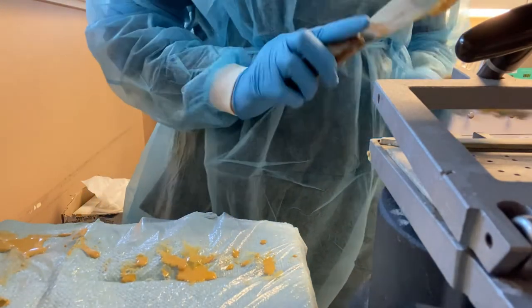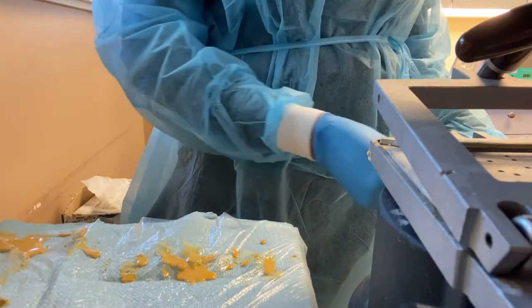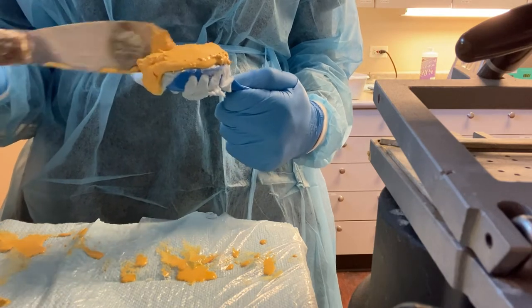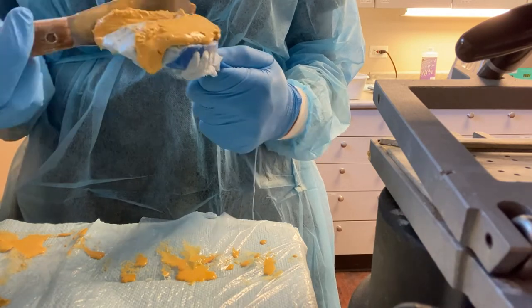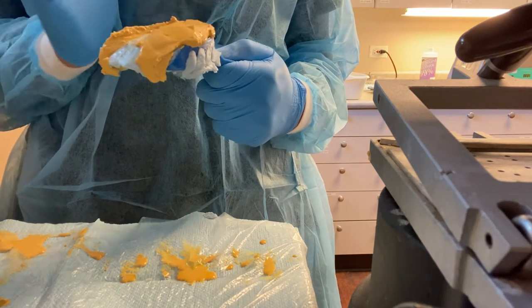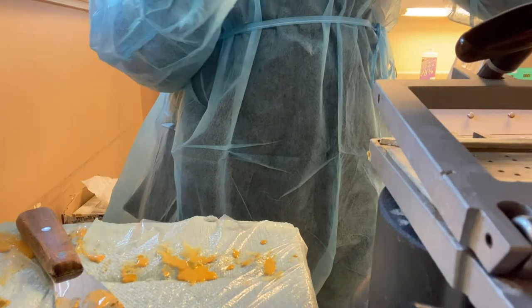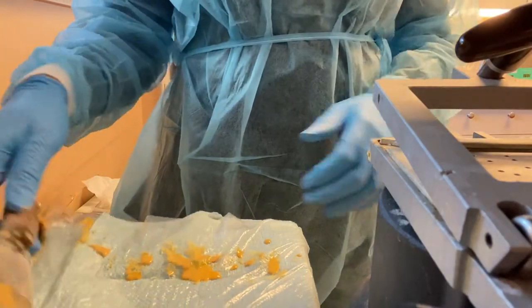Also, you may have noticed that this base is pretty thin. A lot of times when you pour up models to send out to labs, you want to make sure that base is really thick, thick as in inches. The reason I'm making this base so thin is because we're making in-office whitening trays. If you've ever made whitening trays, you have to use a suck down machine, and a suck down machine works best when the base is skinny. If the base is really thick, you're going to have either bubbles in your tray or it's not going to adhere to all of the teeth correctly. That's why the base is so thin, because they're only going to be in-office whitening trays.